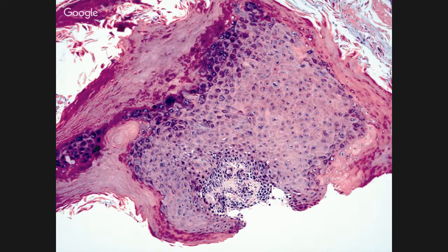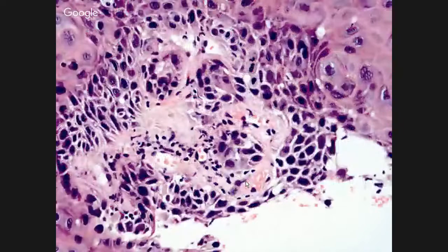It'll take the stroma along with it, so we generally see that, but not always. Or in a biopsy like this, where there's very little stroma, what do we do? And there is dysplasia here. So is this microinvasive cancer? In general, the treatment for high-grade dysplasia and microinvasive carcinoma is about the same. So we don't compromise ourselves if we don't make an absolute diagnosis.